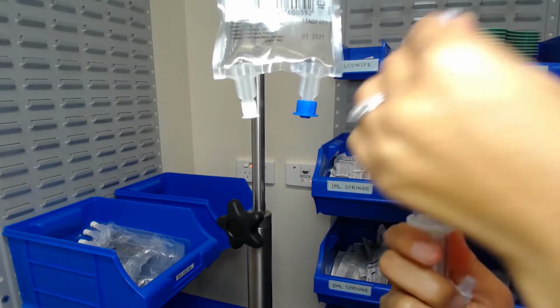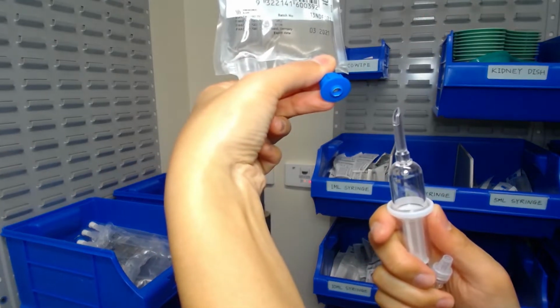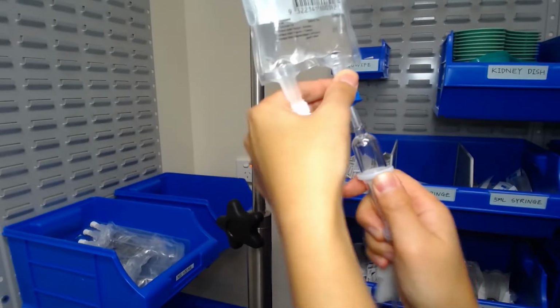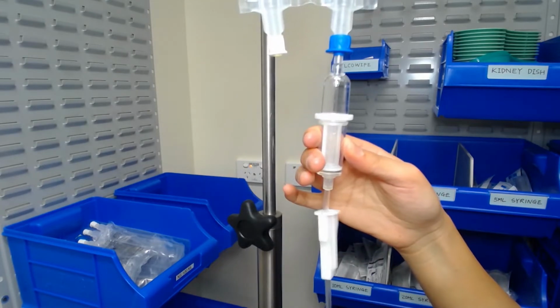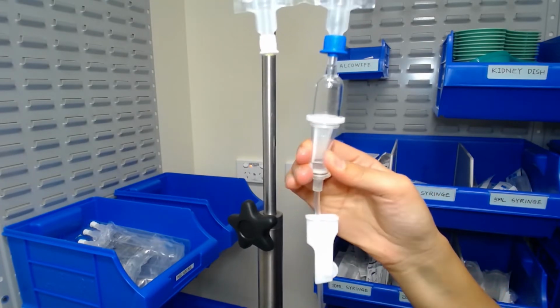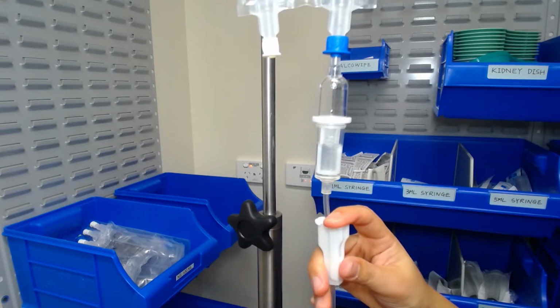You can now remove the cap off the spike and connect it to the IV tubing port on the IV fluid bag. Do so without contamination. Here I'm squeezing the drip chamber to fill to 1/3 to 1/2. I'm proceeding to slowly release the roller clamp in order to prime the line.